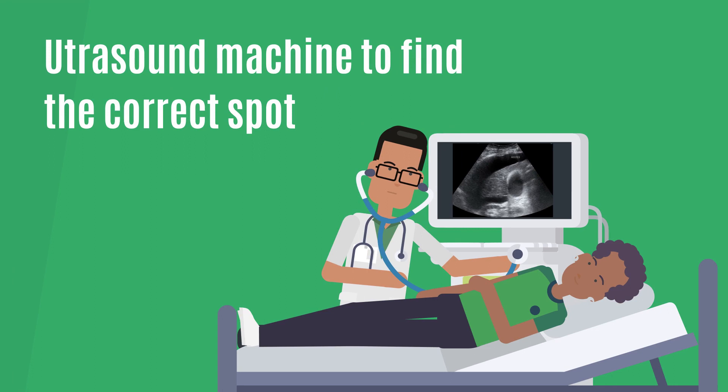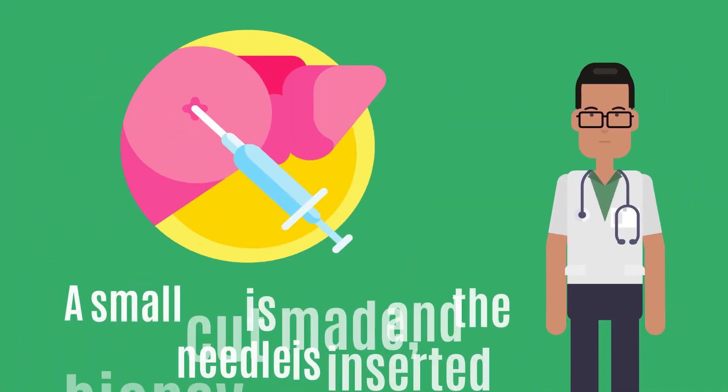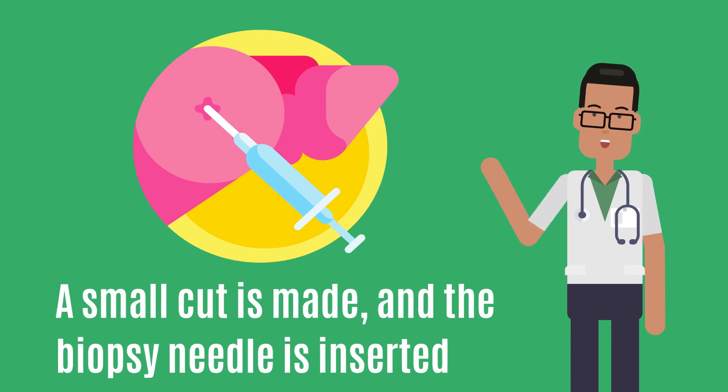Your doctor will use an ultrasound machine to find the correct spot for the biopsy needle. Then, the skin is cleaned and numbing medicine is injected using a small needle. A small cut is made and the biopsy needle is inserted.